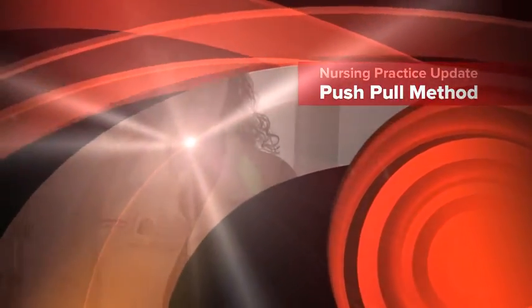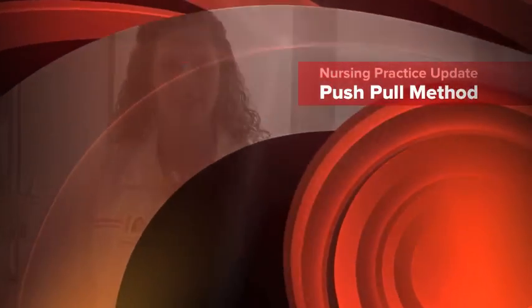Push-pull is a technique used for fluid resuscitation in urgent patient situations, such as severe dehydration, sepsis, compensated shock states, as well as uncompensated shock states. In general, the physician will order a fluid bolus of 10 to 20 cc's per kilo of isotonic IV solution, such as normal saline or lactated ringers.